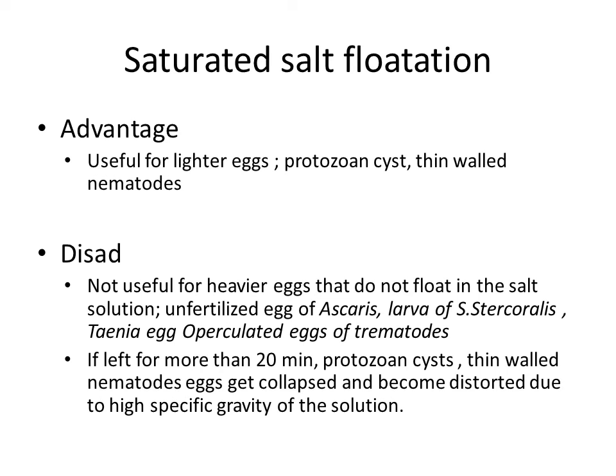Another disadvantage: if we keep them more than 20 minutes, protozoan cysts and thin-walled nematode eggs collapse and deteriorate due to the high specific gravity of the solution.